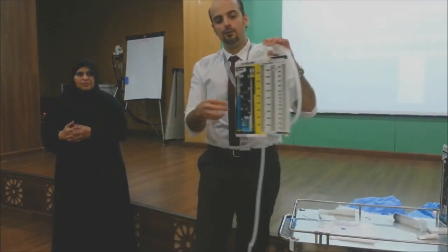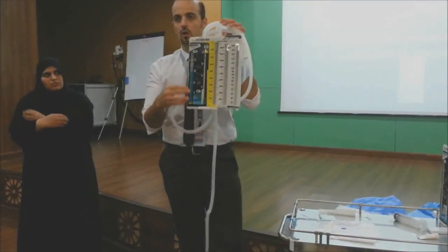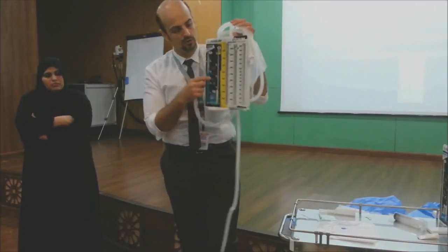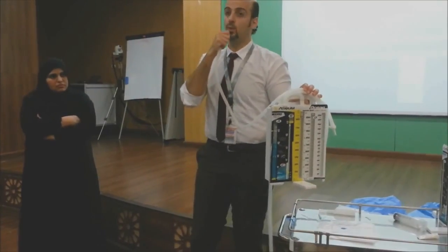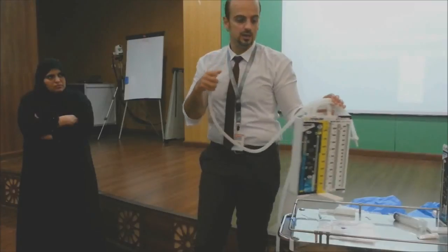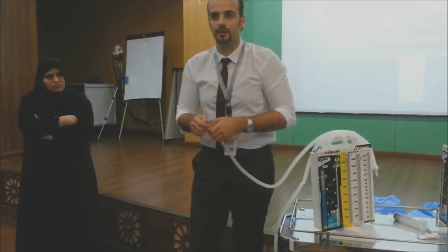But if we play with this, either more or less, if I'm putting more water here till here, I cannot blow. I will feel resistance. So instead of draining 10 liters per minute, I will drain 1 liter per minute.